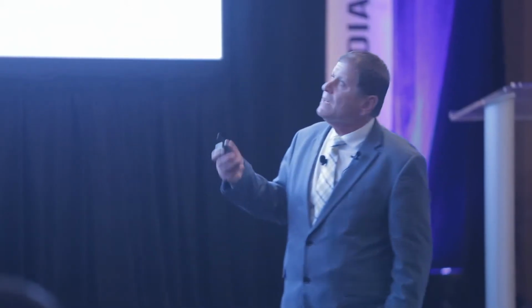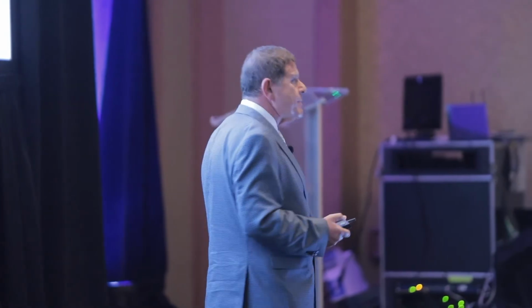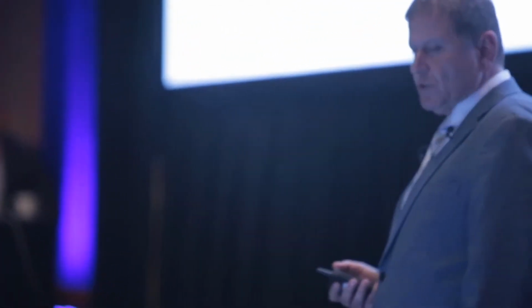Now, when I went into the literature and started to review those articles, I was shocked. What are the characteristics of this material? So I will summarize some of them. The material is non-toxic, an extremely biocompatible material. There is no host response.